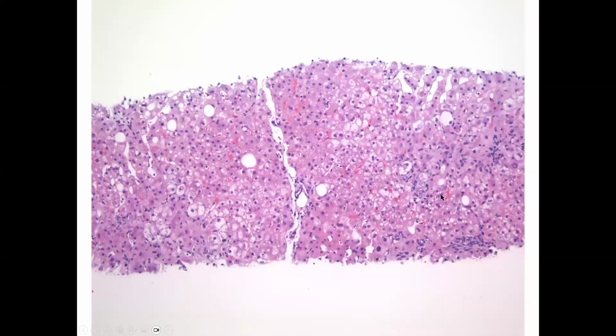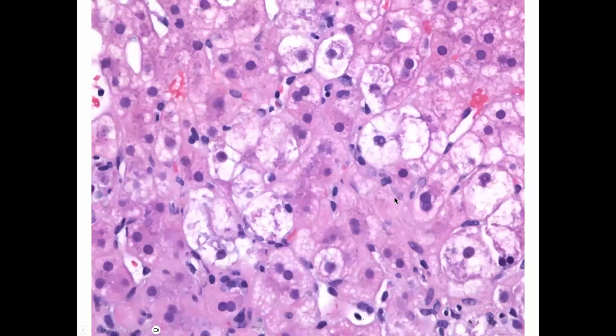Here's an abnormal liver. We can see some areas where the hepatocytes look similar to what we'd seen before, but other hepatocytes look a lot larger and a lot paler staining. Let's take a look at these on higher power. Compared to the background normal-looking hepatocytes, these are maybe 4, 5, or 6 times as large, with really cleared-out cytoplasm. These really enlarged cells with very cleared-out cytoplasm are ballooned hepatocytes.